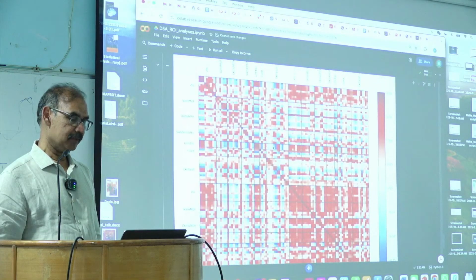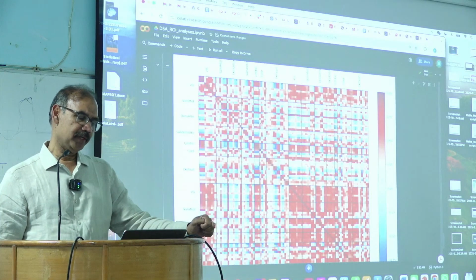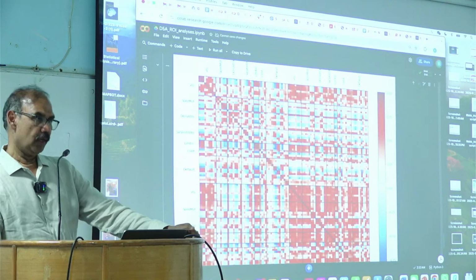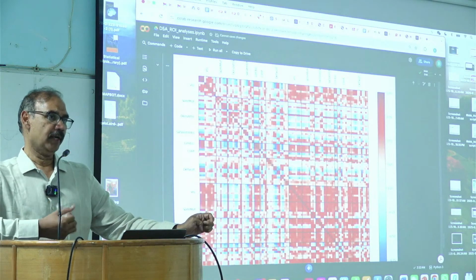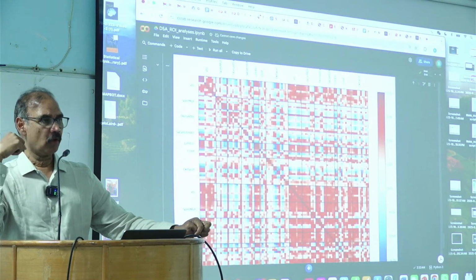So what we will cover is graph theoretical measures, and the idea in this one is that you can use ICA to find connectivity patterns. Or you can take a seed-based analysis from one region and correlate with all other regions.